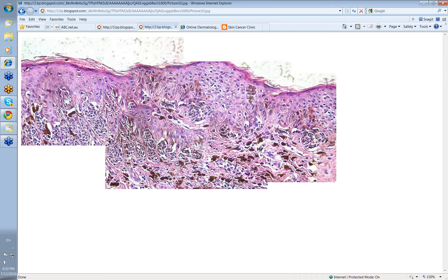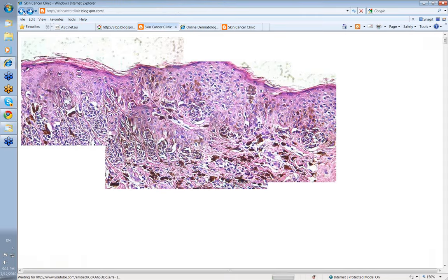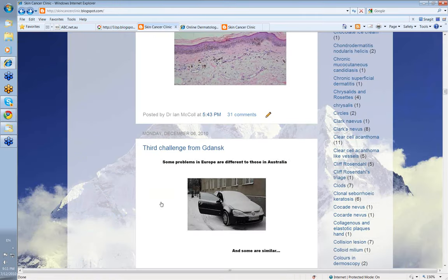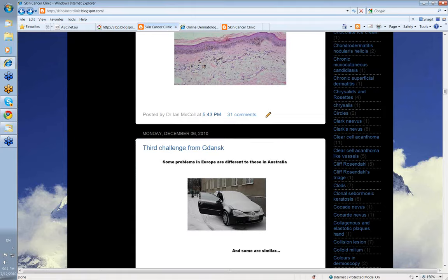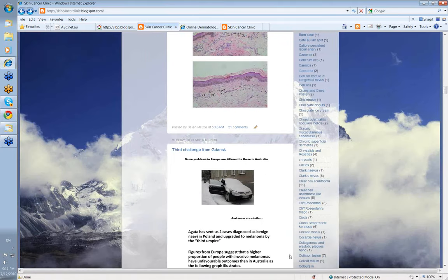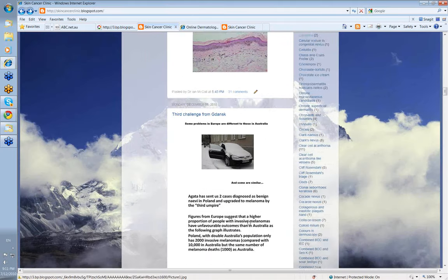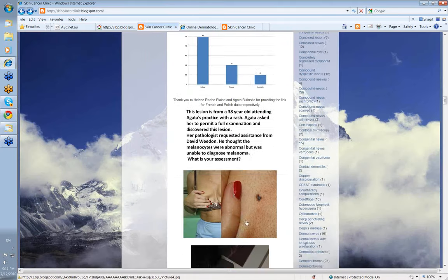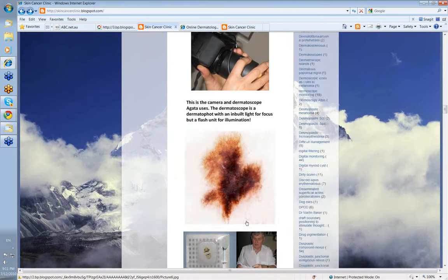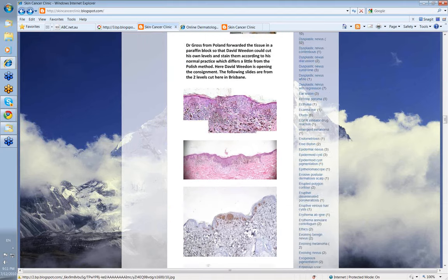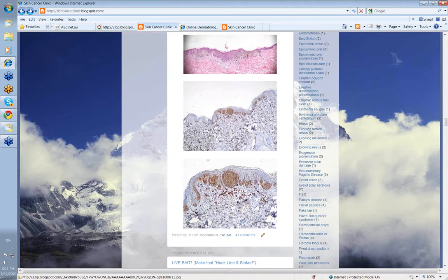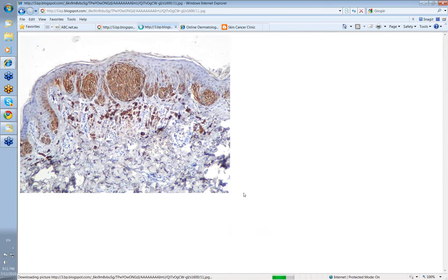Now, shrunken pagetoid cells are present high in the epidermis with pigment in the stratum corneum. So I can see why to the dermoscopist it actually looked like a melanoma. He did some other special stains on this. Now those special stains were actually sent out by Dr. Grace from Poland.